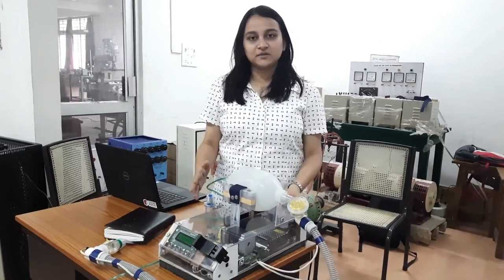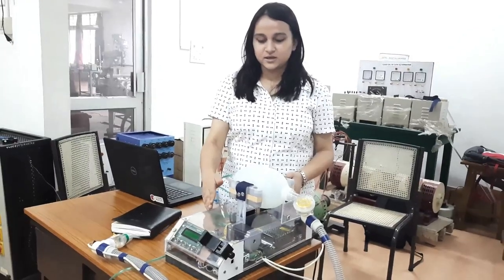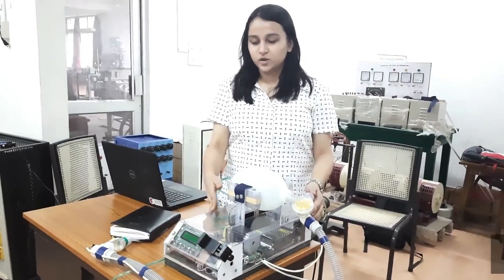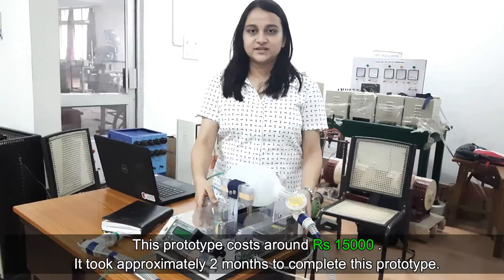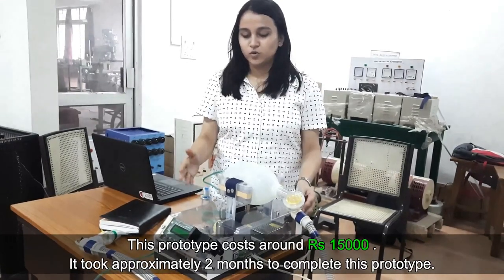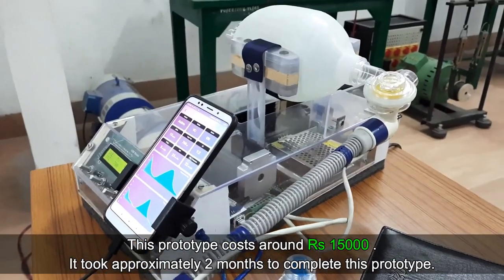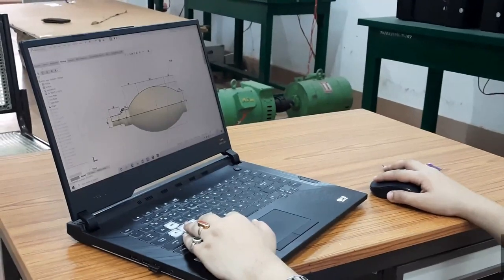The number of ventilators present in the hospitals is very small compared to the patients in the ICU. So this model presents the design of a low-cost portable mechanical ventilator equipped with Bluetooth technology, which we can control and also monitor the ventilatory parameters through mobile phone, laptop, computers, etc. It is also low cost, compact, lightweight, and thus portable.